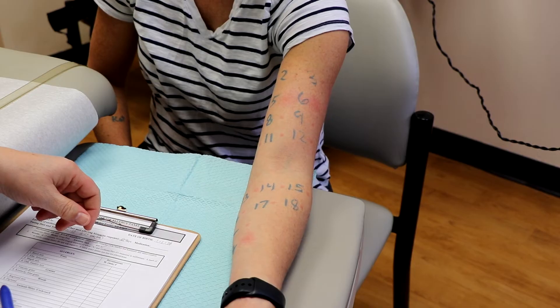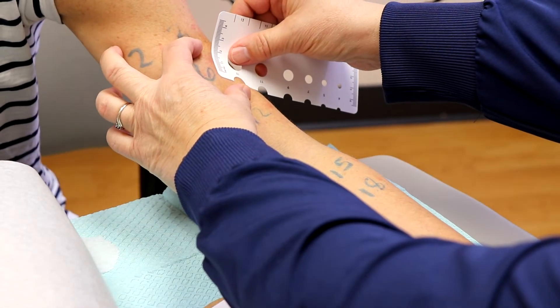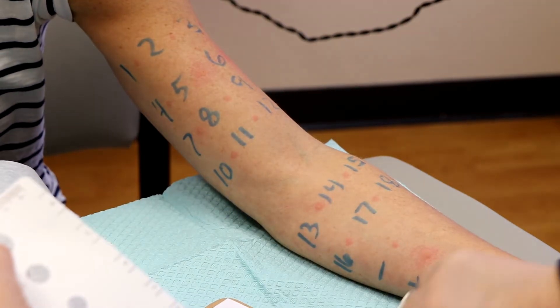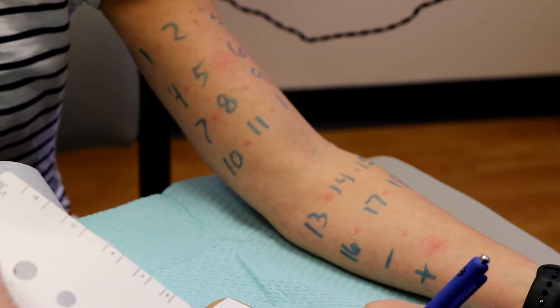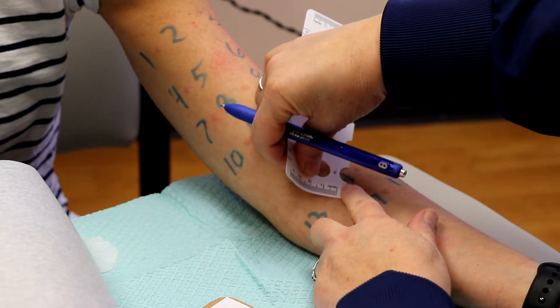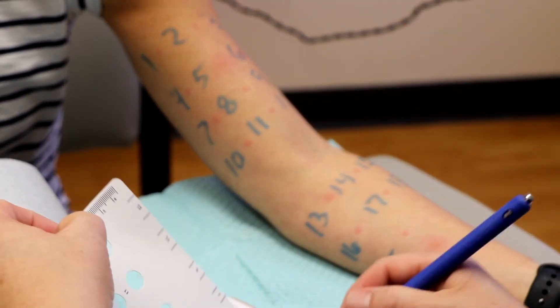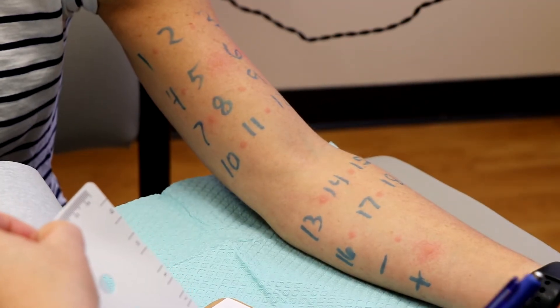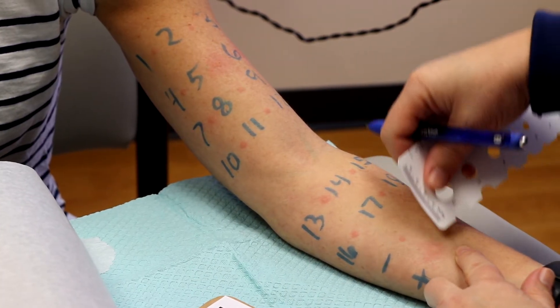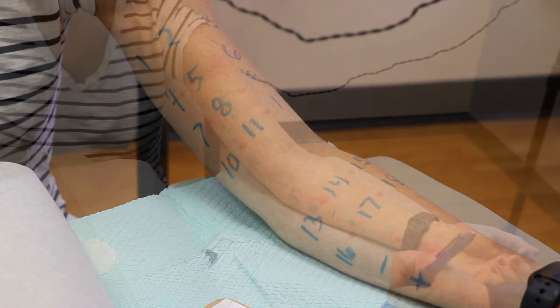Next, the nurse will measure any positive skin reactions. There will be two different measurements. First, the wheal — what looks like a bug bite or a bump in the center of the skin reaction — will be measured. Then the flare, which is the redness around that bump, will also be measured. Allergens that show this type of reaction will be compared to the positive control. After the measurements are complete, a form is given to the allergist to interpret the results.